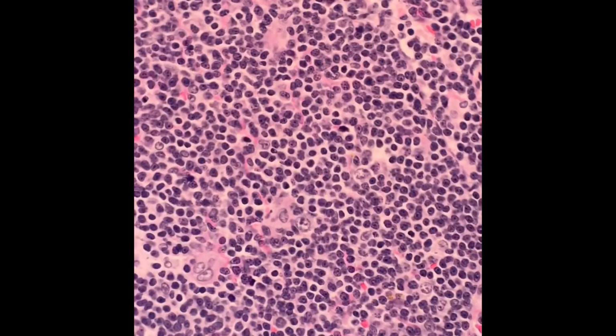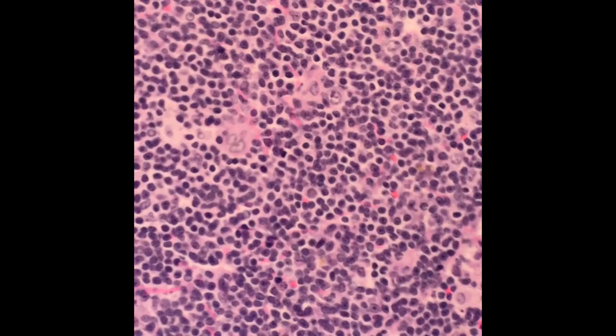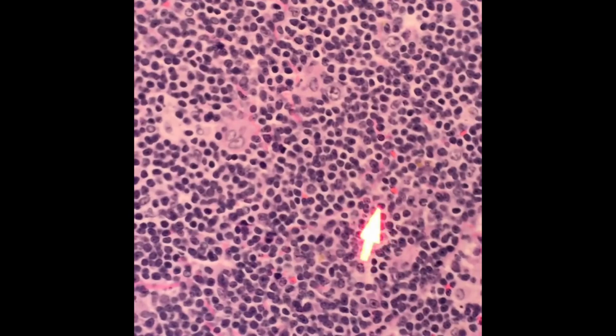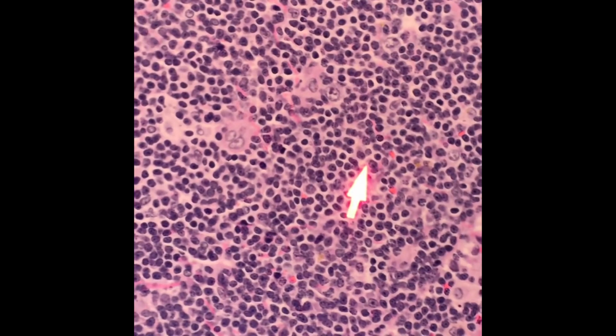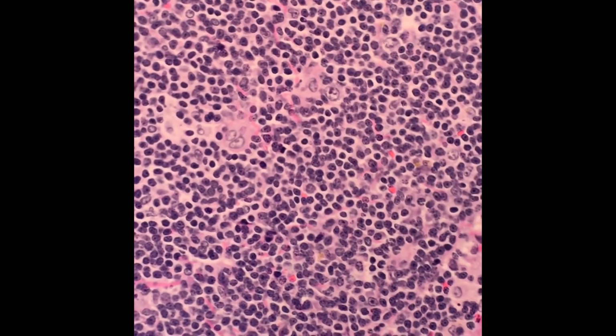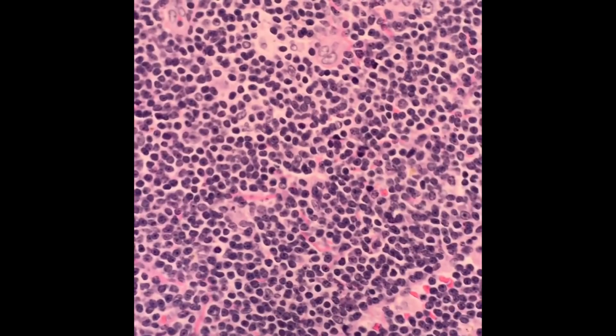And now we're going to take a look at another area. A lot of it's around these sinusoids. And what we start to see is plasmacytoid differentiation of cells. Here's some eccentric nuclei, amphophilic cytoplasm, perinuclear hof. We start to get some clock-face nuclei in here too.